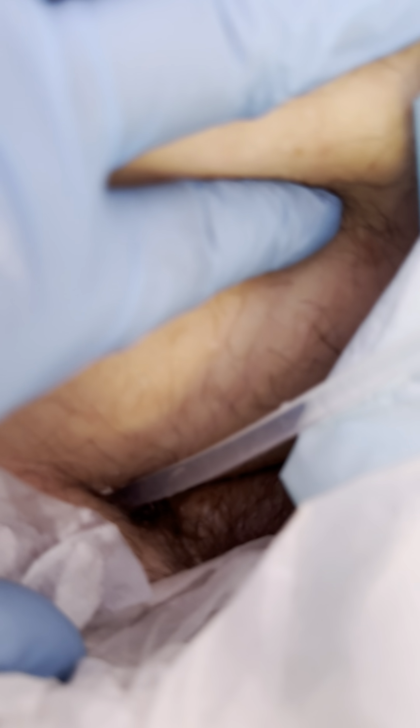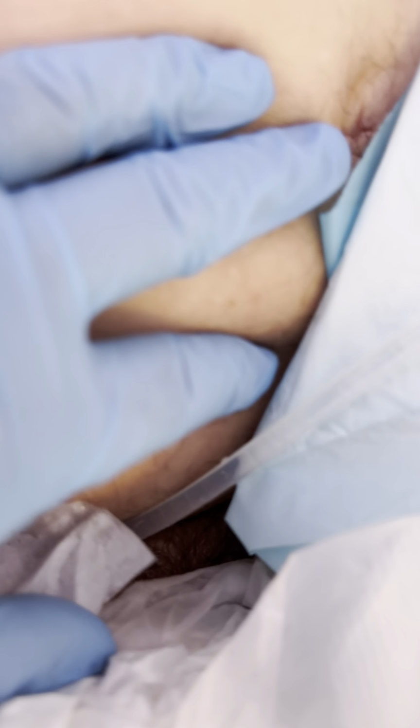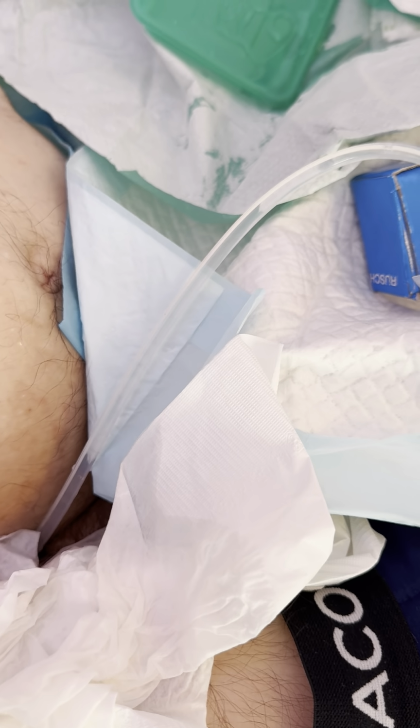So you see this little bit of blood? That is not even a mil, that's nothing. And then I have a complete, beautiful, clean tube and a completely clean site. Even though it doesn't look clean, I've got to clean it, but absolutely beautiful. And a complete flow.